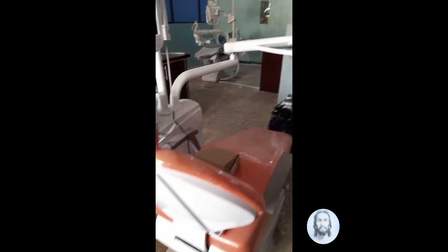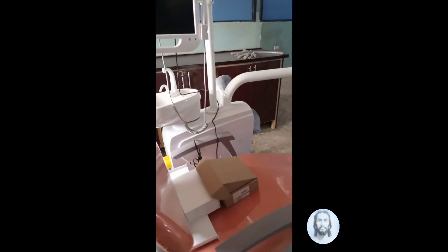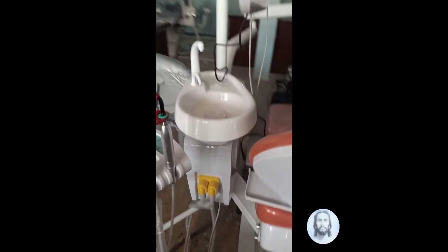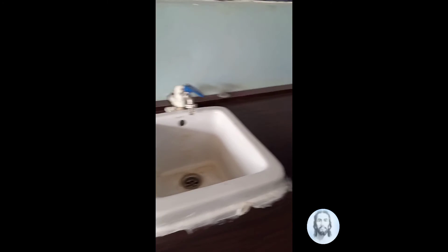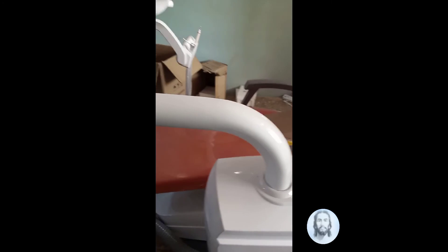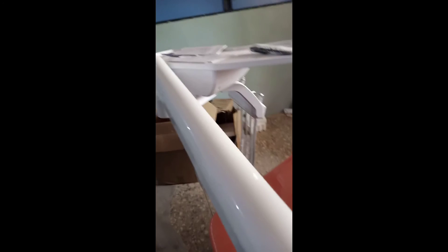This forms part of the dental unit — we have a little lab with a sink to assist the unit, as part of the dental unit. Thank you.